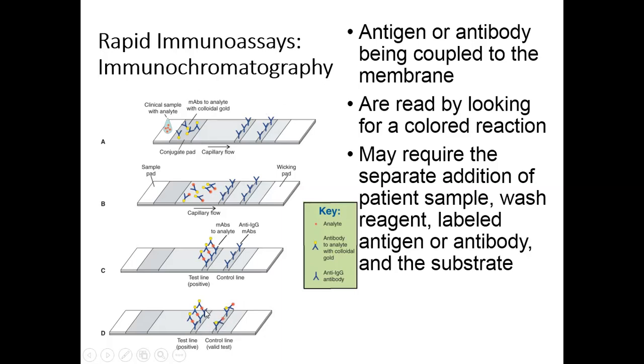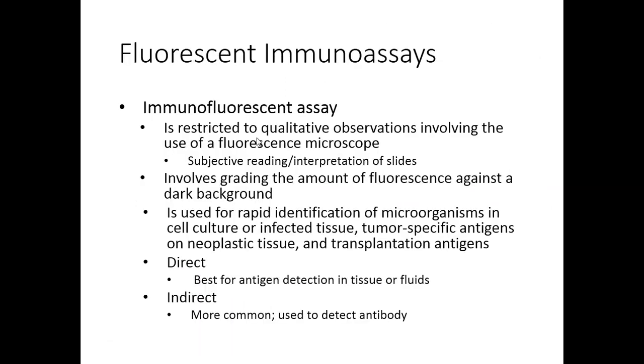So you have to get a positive result in both of the detectors in order for us to call this test positive. If nothing happened here, you would still have to have a positive control value here, or the test is invalid. This is our control that shows that this managed to wick off in a high enough concentration all the way to the end that it would detect any antigen that was present. Simple, right?